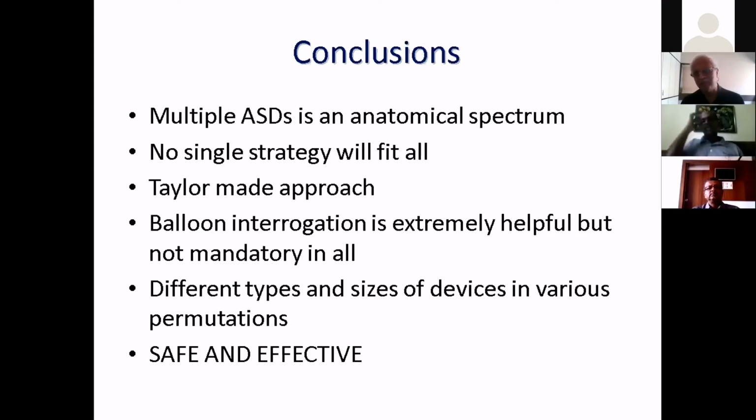Unless you really put the device in and multiple times you have to recapture the device and redeploy the device, that is the only time I have seen the intervening tissue getting torn. But only sizing of the balloon, just by increasing the pressure a little bit, and that would be in a sizing balloon, the maximum pressure you can generate with the help of a 20 milliliter syringe is not more than 2 atmospheres. So I don't think that is really a practical fear. I don't think you should worry about it.